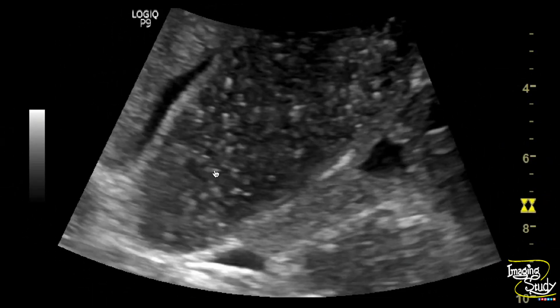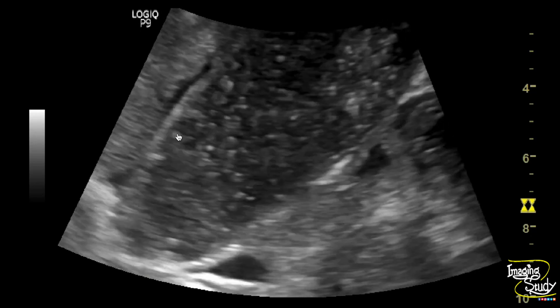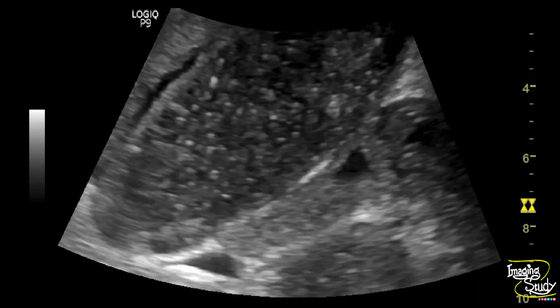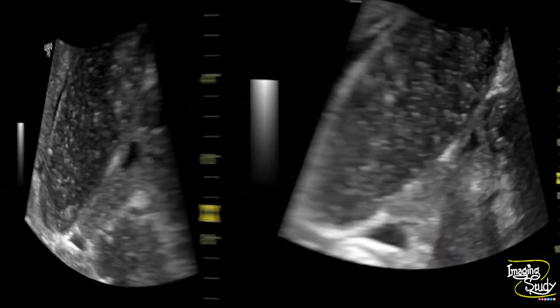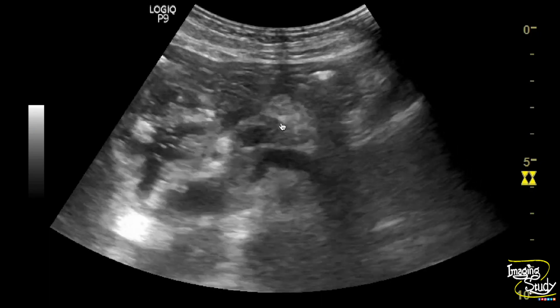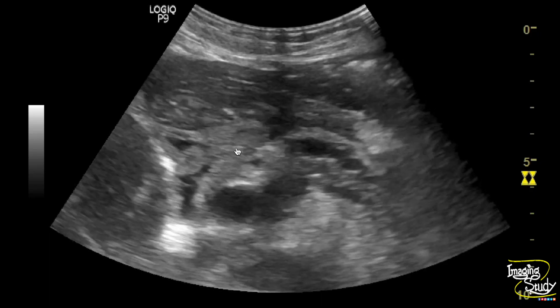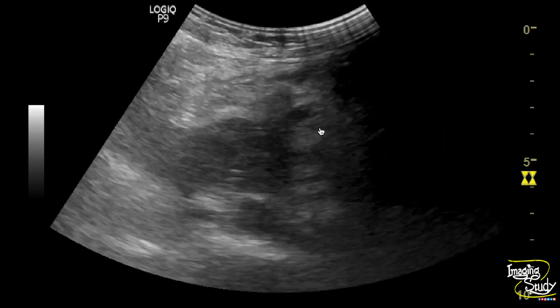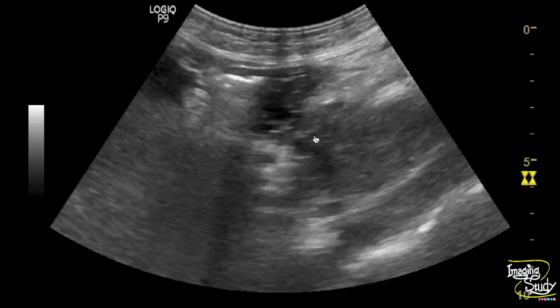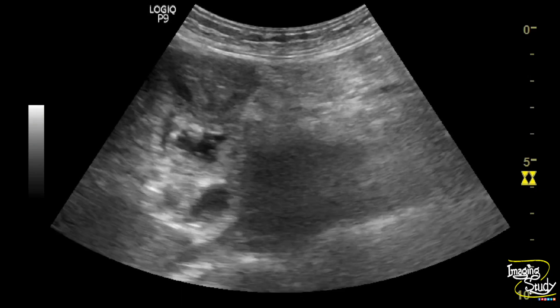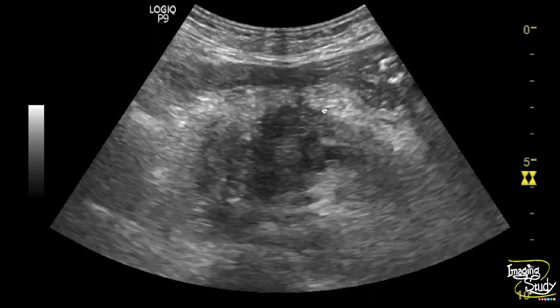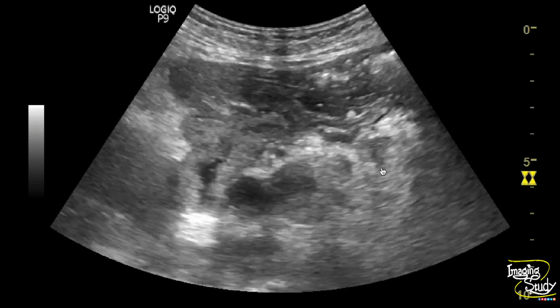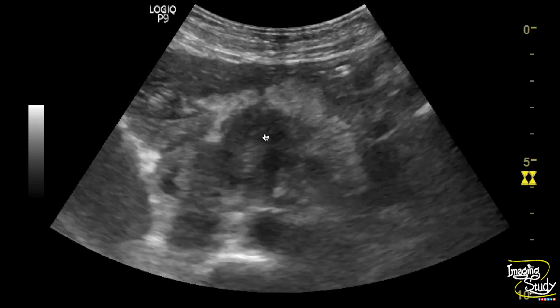Here is the magnified image to evaluate the comet-tail artifacts further, and you can also see adjacent hypoechoic sludge here. Here at the epigastrium, you can see an irregular, ill-defined, heterogeneously hypoechoic mass lesion at the pancreatic head region. The main pancreatic duct is dilated, so this mass lesion at the head of the pancreas causing obstructive features is possibly a malignant lesion.